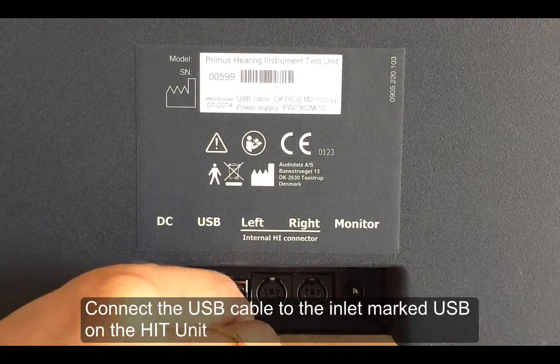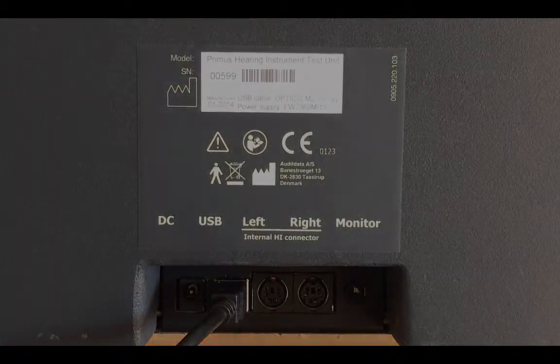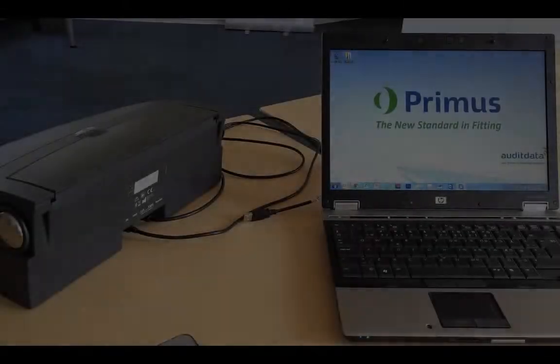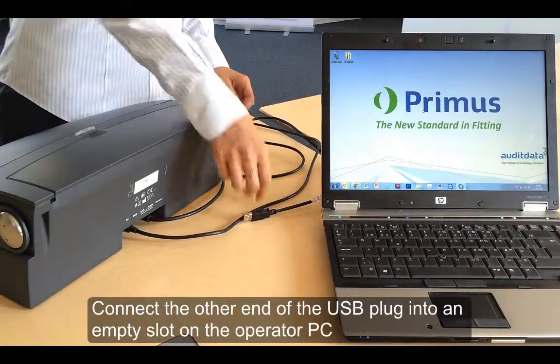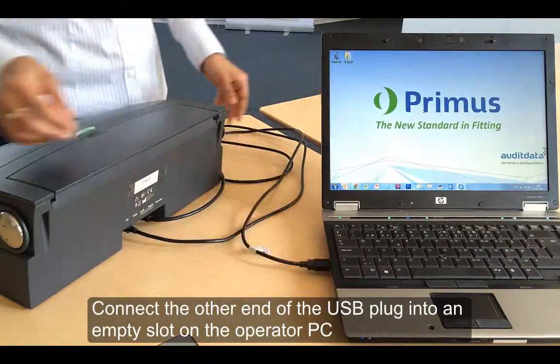Locate the USB cable and connect it to the inlet marked USB at the back of the unit. The other end of the USB cable will need to be plugged into the operator PC.